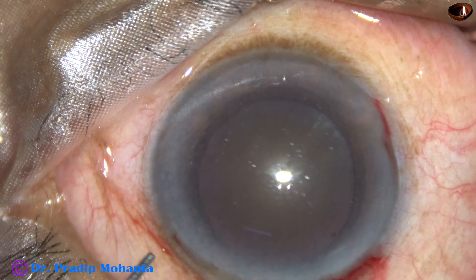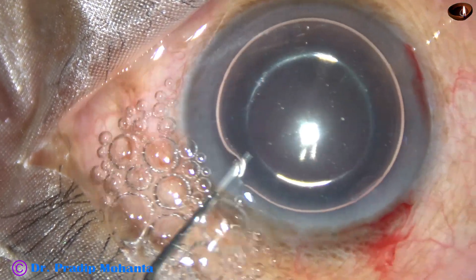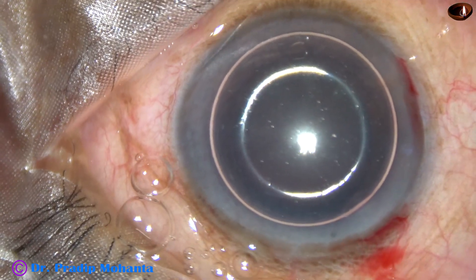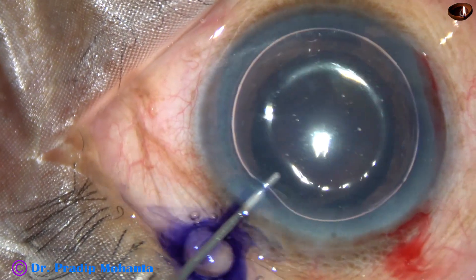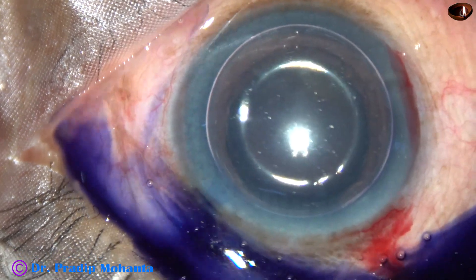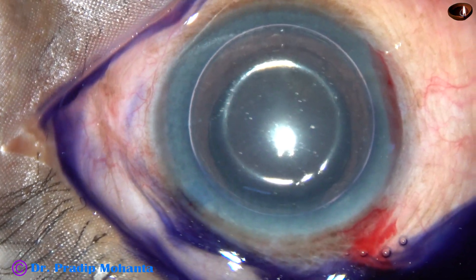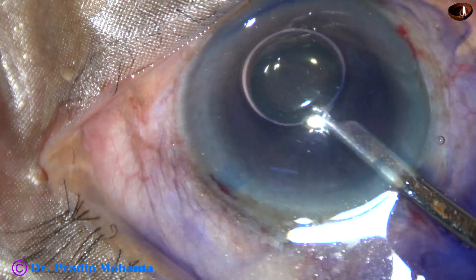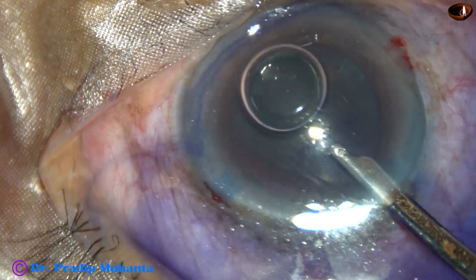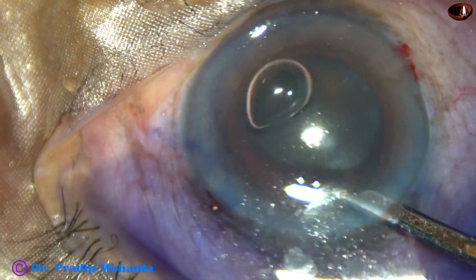An air bubble is injected into the anterior chamber. Beneath this air bubble, trypan blue dye is applied over the anterior capsule of this hard cataract. This staining of the anterior capsule will provide some contrast during capsular access.